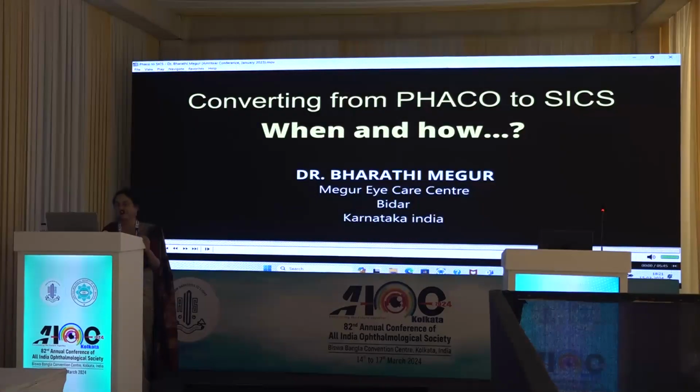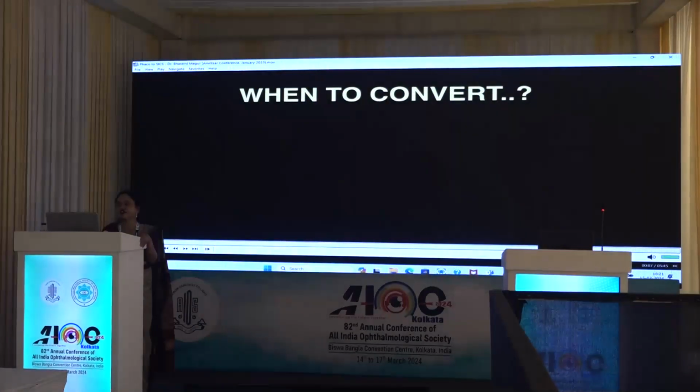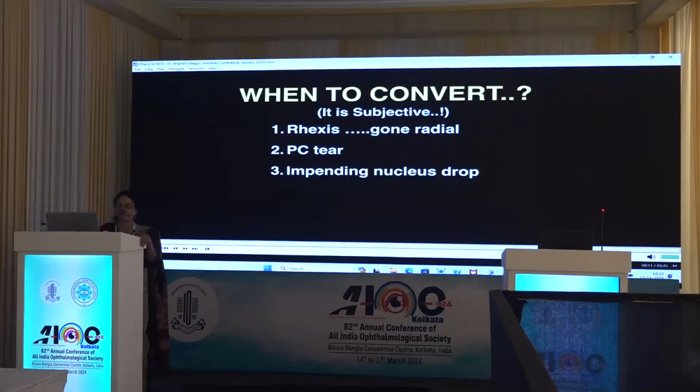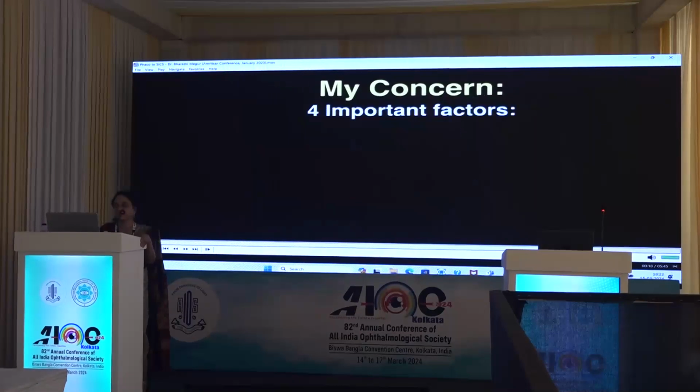So this is a talk on how to convert from phaco to SICS, when and in what situation you are going to convert. So a probable helping hand for a phaco surgeon is small incision cataract surgery. When do we convert? Whenever there is a rhexis which has gone radial, there is a PC tear, there is an impending nucleus drop, and a loose bag or zonules.